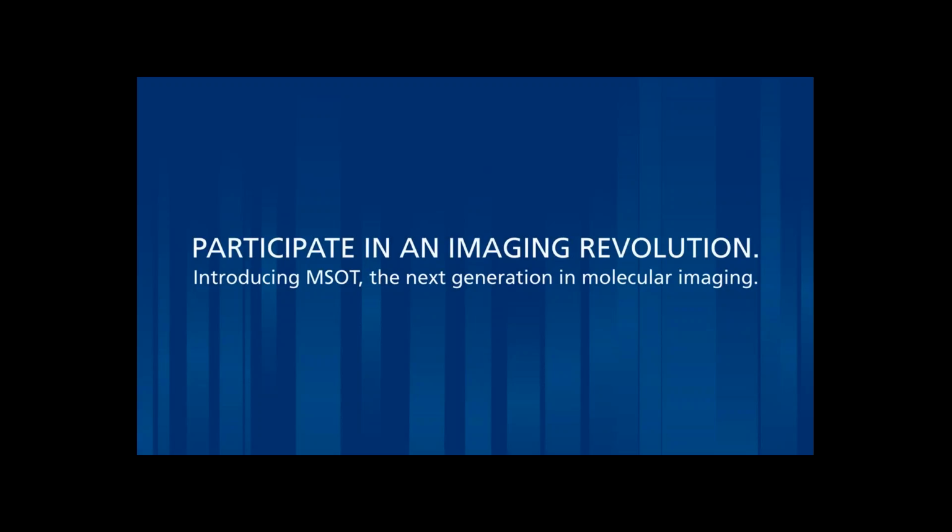If you wanted to scan an entire region, then you need to think about the step size. Our translational stage moves in as small as steps as 100 microns. So if you wanted to image the whole animal in very discrete steps, it really depends on how you want to do the imaging. But at a reasonable step size, it could take as few as 10 minutes depending on how many wavelengths you choose.